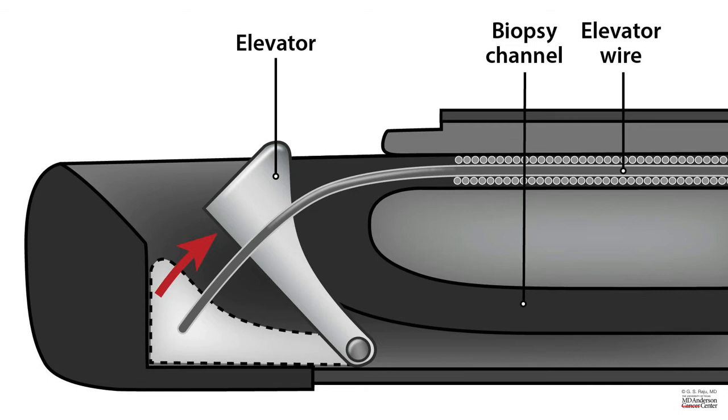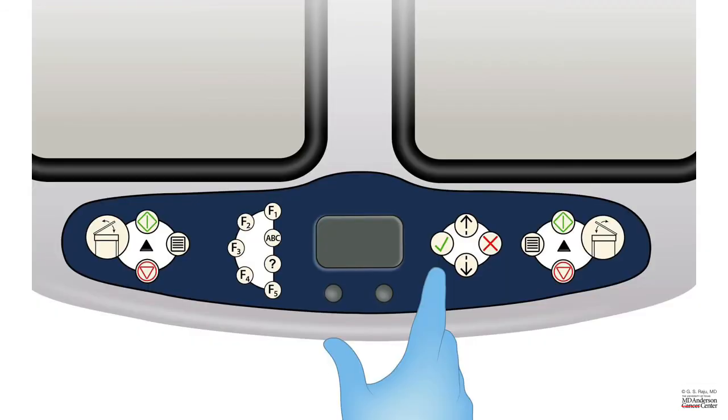So once the endoscope is securely connected with the adapter, loosely coiled, you close the lid and then you start the machine. And depending upon the manufacturer's instructions for use, that's what you should follow. You decide the particular program that the machine has to go through.